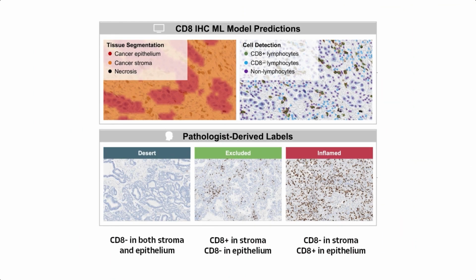On top of that, we were able to layer an extra biomarker analysis, if you will, which is called immune phenotyping. In this case, CD8-based immune phenotyping, where we can train another kind of classifier. In this case, we tried two different independent approaches in order to classify the slide level immune status of these patient samples as either immune inflamed, immune excluded, or immune desert.